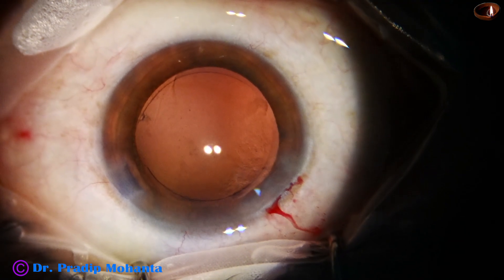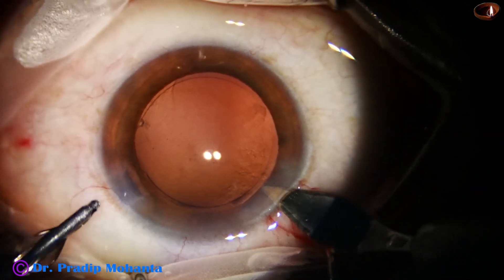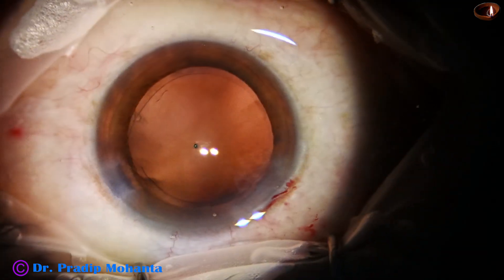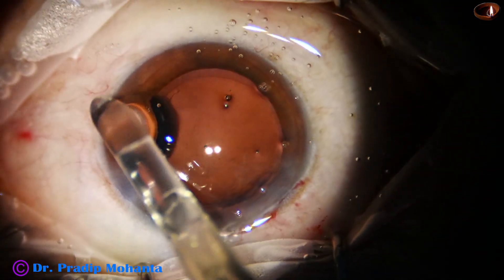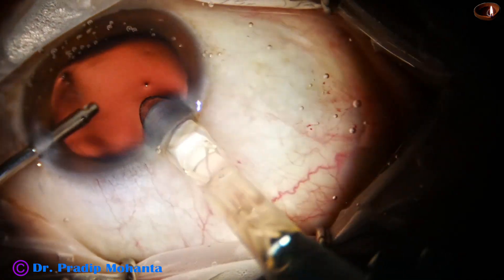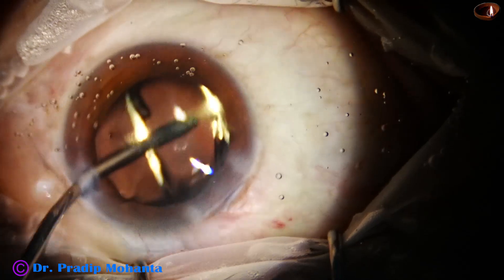Now is the time to implant the intraocular lens. I am using a B cartridge and enlarging the main wound with just one small cut. Here goes the intraocular lens — this is a hydrophobic acrylic single-piece monofocal intraocular lens.